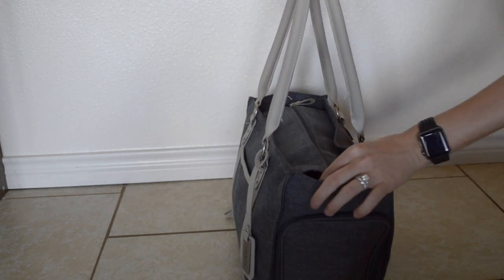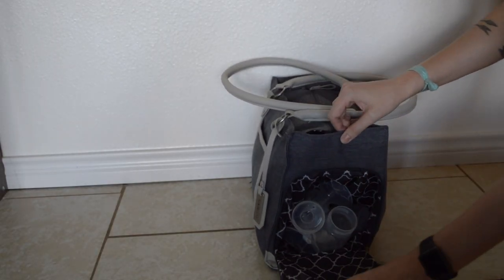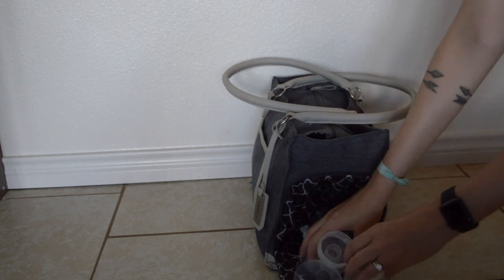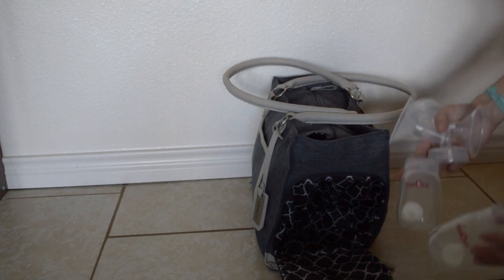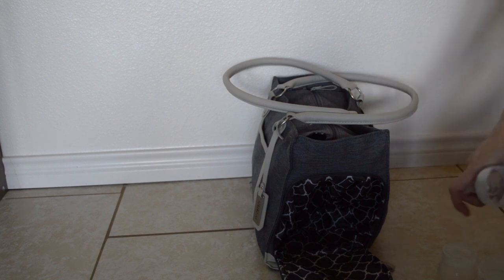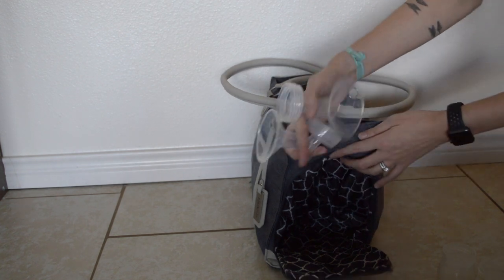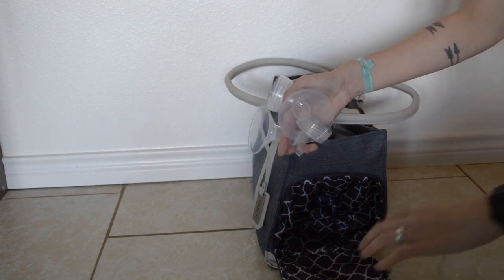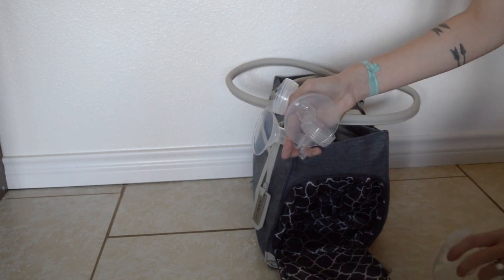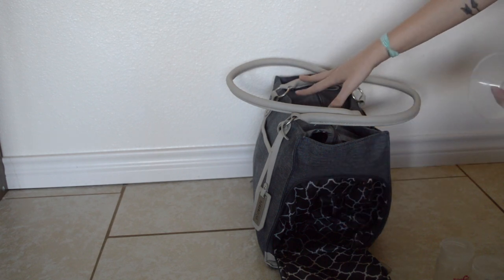On this side I keep my pump parts. I have the Spectra S1, which just means the pump has an internal battery. I keep my two bottles, my flanges, and my valves in this deep pocket because it's a self-contained area. It has a waterproof material, so if there's a little bit of water on these items it won't affect the bag or the contents in the main compartment.